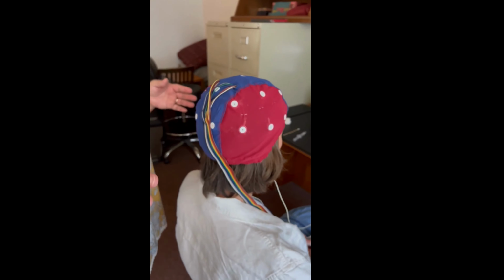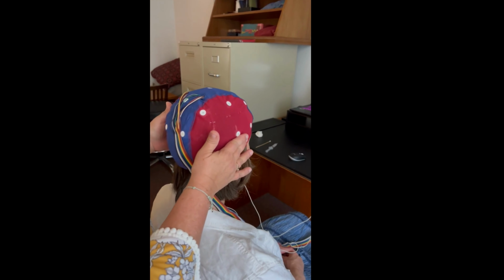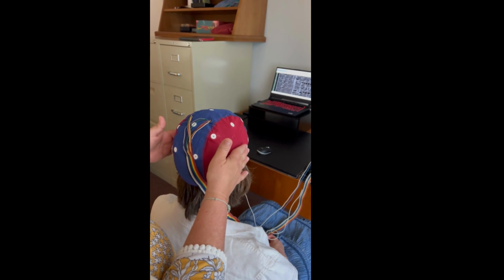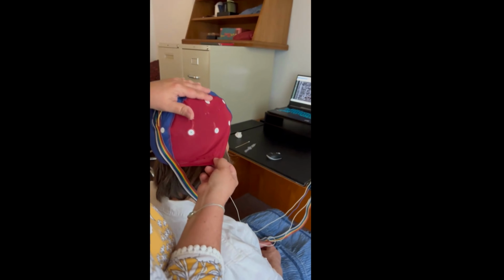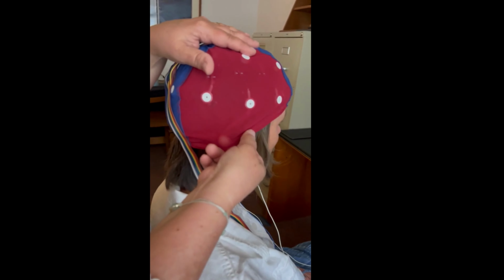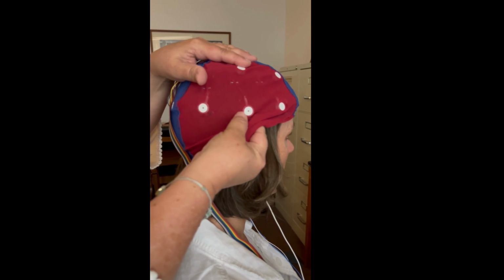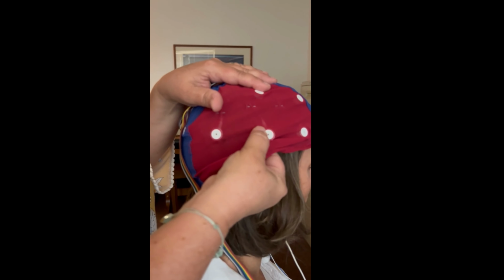Now the hair is one of the things that I wanted to make mention of, especially in the temporal lobes, especially at T3 and T4. So don't be afraid to move your fingers underneath the cap, and you can feel like right here at T3, it's a clump of hair.